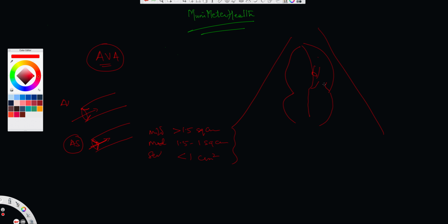So as a result, the blood is going in this direction and coming out through the left ventricular outflow tract, and it'll be out like this. So this being the right ventricle, this being the right atrium, this being obviously the booster chamber, the left ventricle, and left atrium, just to orient my students, residents and fellows. So when we look at the aortic root, we need to know the cross-sectional area of the aortic root. We need to know certain other parameters.